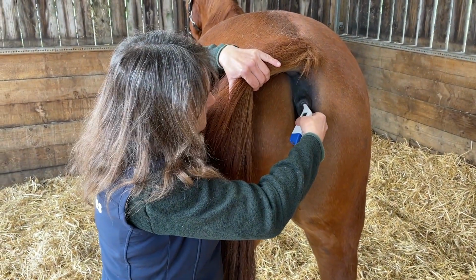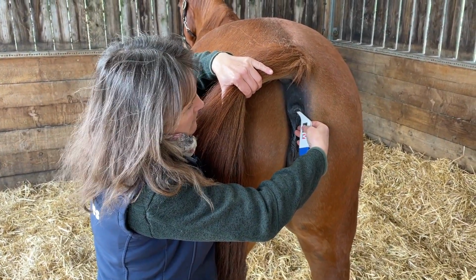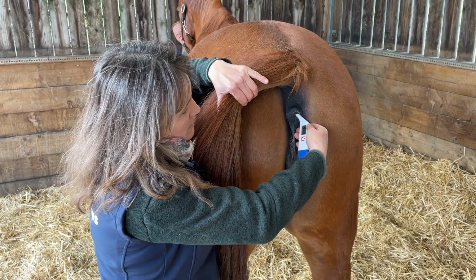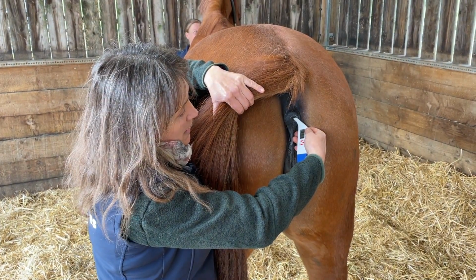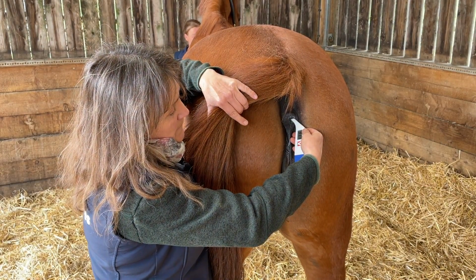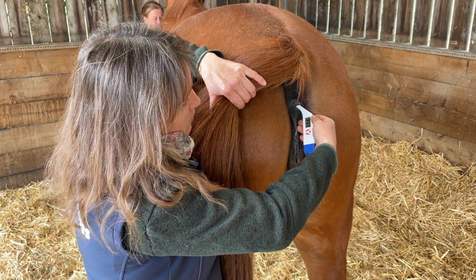And then I'm going to very slightly put it to one side, so I tend to put my fingers rest them on the side of her butt cheek, and then hold it to one side so that the thermometer is taking the temperature of the wall of the rectum and not the air or perhaps droppings that are in the rectum.